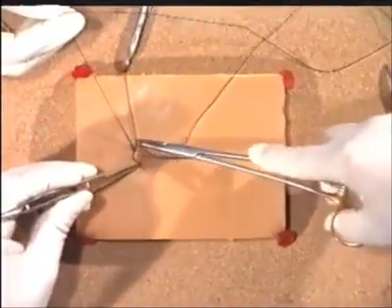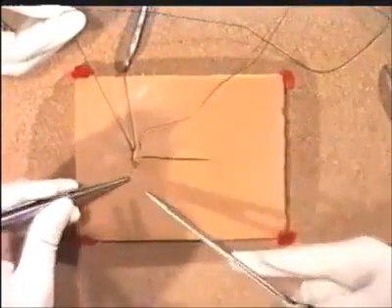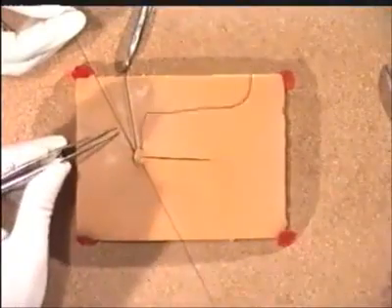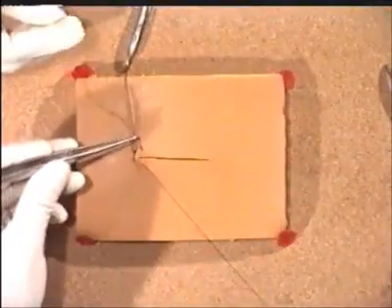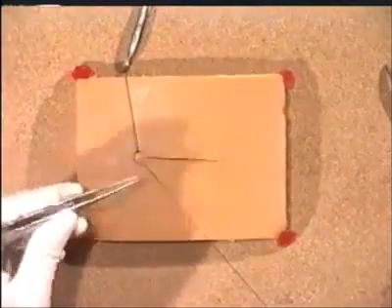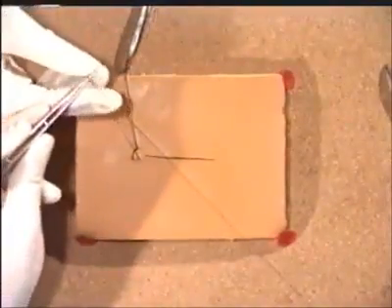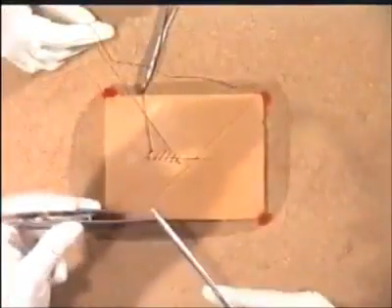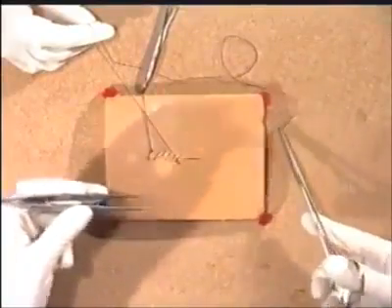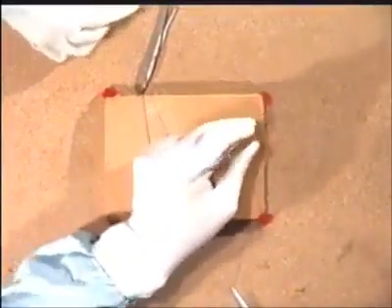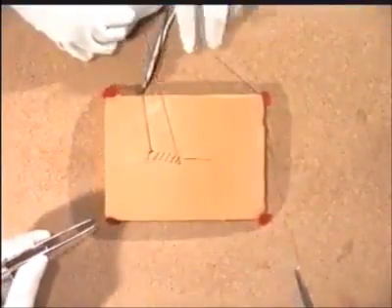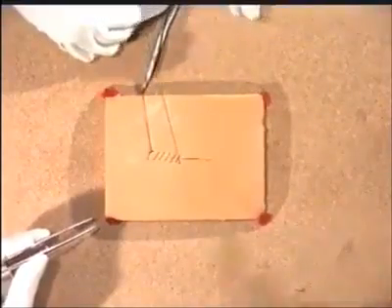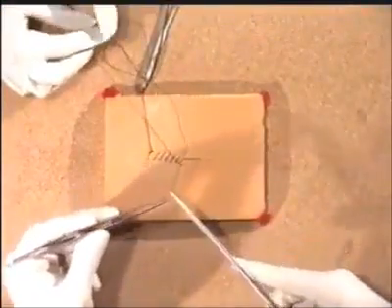Then continue suturing. As you insert the suture, and pull it through gently, your assistant should release the suture, and allow you to snug it down. Pass it again to the assistant. As one continues along the incision, it is important that the suture material does not get caught around instruments, as you see here, and your assistant should remain alert to such a danger.